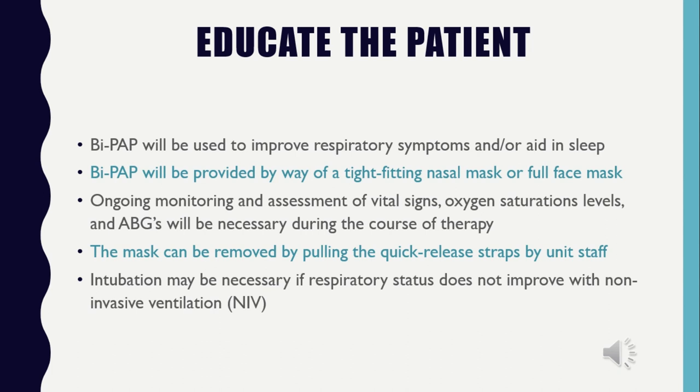The mask can be removed, and we want to let them know that if they need to drink some water, if allowed by their physician, and also to clean their face and to make them as comfortable as possible. Also, the next step, if they do not use the BiPAP and the respiratory status does not improve, would be intubation, which we are trying to avoid. And so if they cooperate, we would have a better outcome in the end.